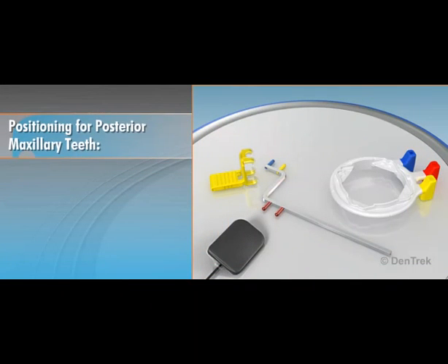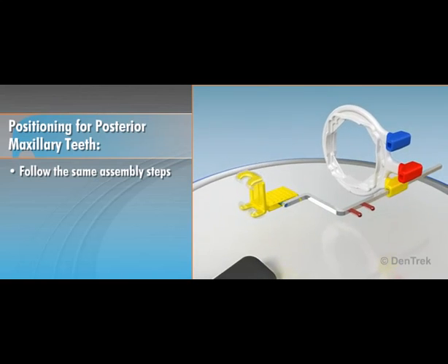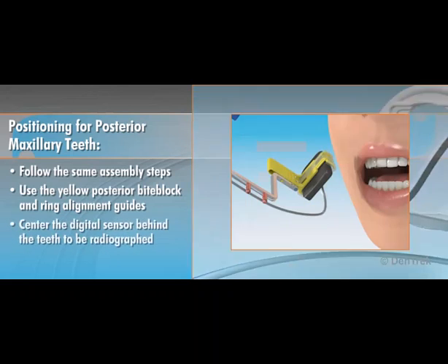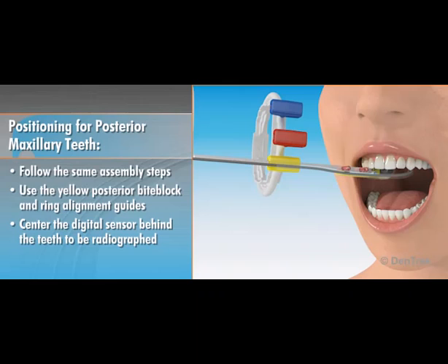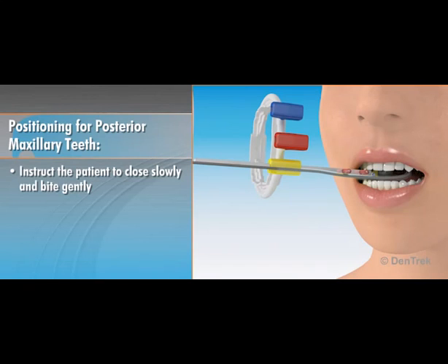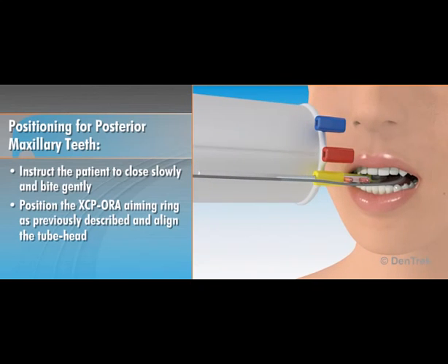To position the XCP-DS-FIT digital positioning system for posterior maxillary teeth, follow the same assembly steps using the yellow posterior bite block and ring alignment guides. Center the digital sensor behind the teeth to be radiographed using the entire length of the bite block so that the sensor is positioned along the midline. With the bite block placed on the occlusal surfaces of the teeth, instruct the patient to close slowly and bite gently. Position the XCP-ORA aiming ring as previously described and align the tube head.